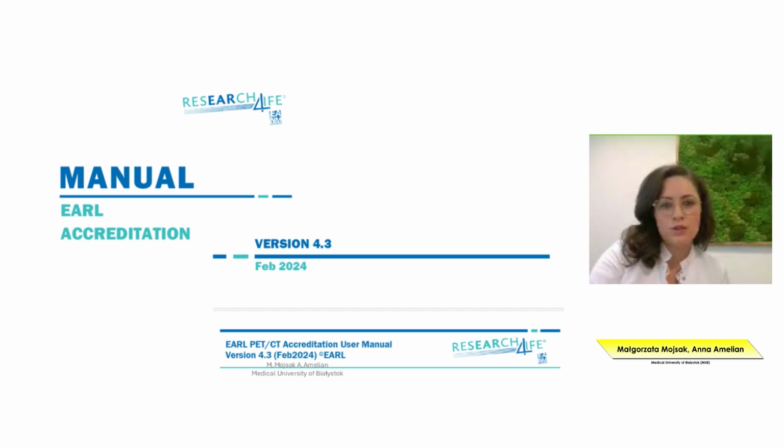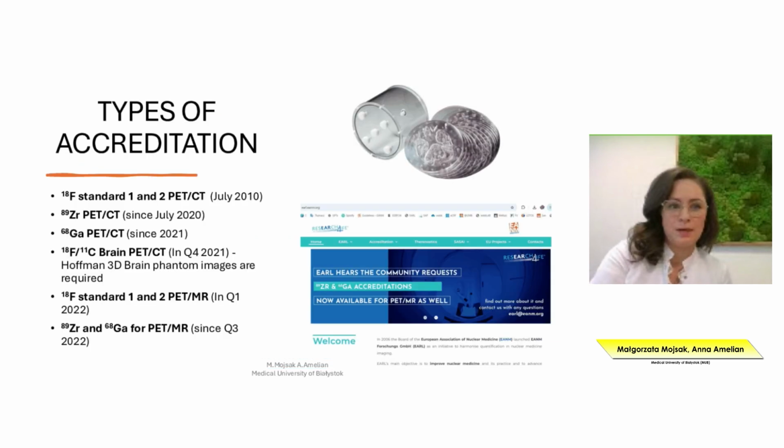Here you can see the manual for this accreditation, and it provides the certification step by step. So you can always contact the EARL team directly if you have any doubts or questions. I'm sure the experts will provide you with proper information and guidelines on what to do in order to make sure that we use our scanners properly.